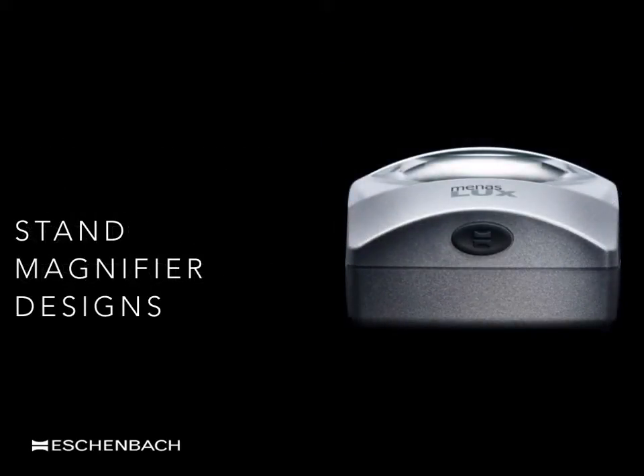So what is the definition of a stand magnifier? The device pictured here is a commonly used and prescribed device. It differs from a hand magnifier by one significant difference: this stand magnifier sits directly on or over a flat surface such as a page or a photograph. The lens therefore sits at a fixed distance. For those who find holding a hand magnifier awkward or find it difficult to keep steady, a stand magnifier is far easier to maintain focus.